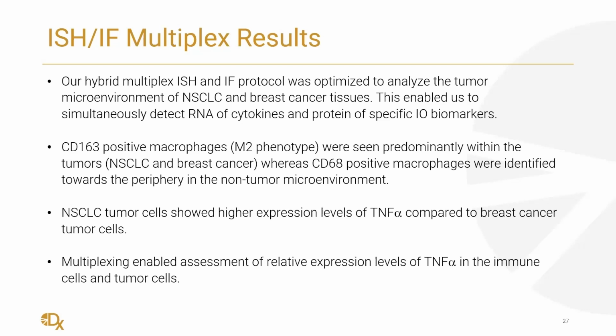NSCLC tumor cells showed higher expression levels of TNF-alpha compared to breast cancer tumor cells. This multiplexing enabled assessment of the relative expression levels of TNF-alpha in the immune cells and tumor cells.